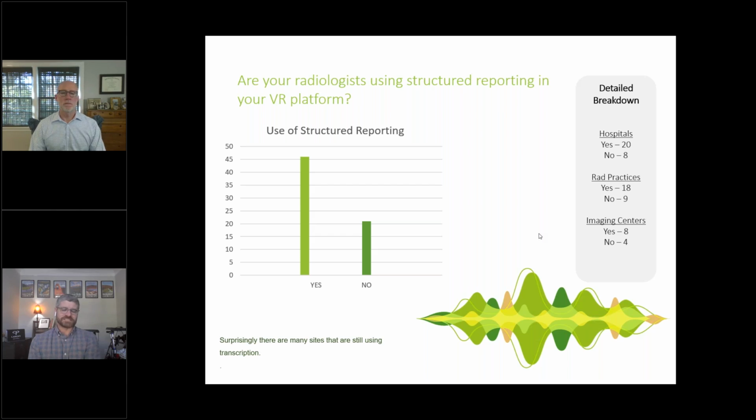And so it's not like the radiologist is having to sign back on at 10:30 at night to sign off the reports. I mean, that would obviously be unacceptable to emergency rooms. And even the outpatient world these days is expecting turnaround time quicker than that. So we're seeing that different kind of editor concept continue to hang around just in the name of radiologist speed and efficiency, which is pretty interesting.